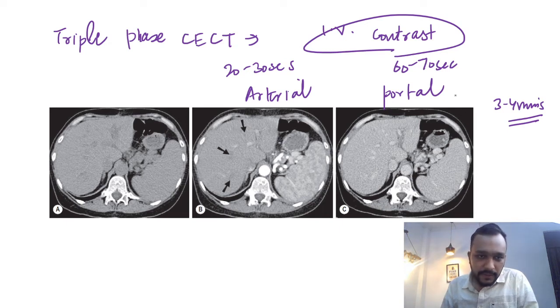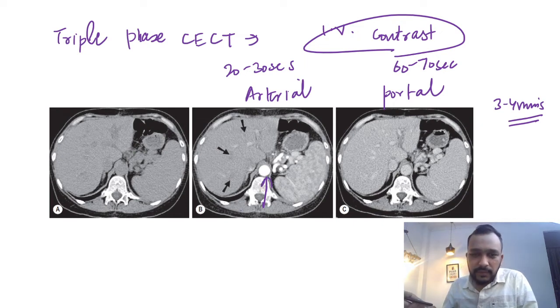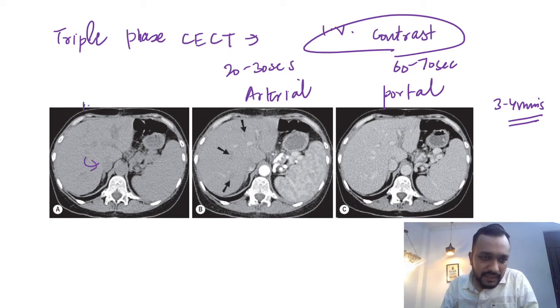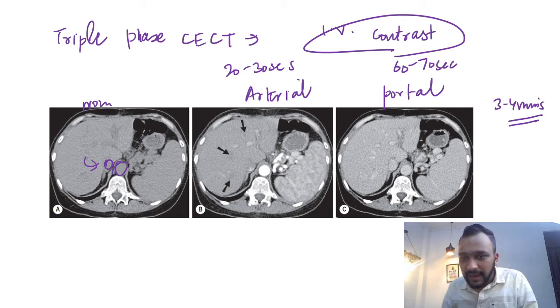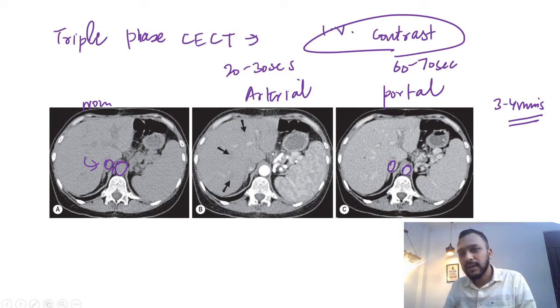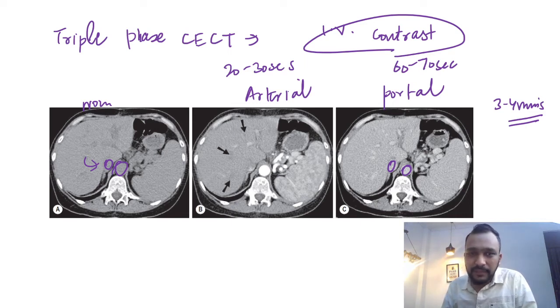To identify these phases, we look at the enhancement of the aorta and IVC. In the arterial phase, only the aorta is enhancing and the IVC is not enhancing much. In the non-contrast phase, both IVC and aorta are not enhancing. In the portal venous phase, both the aorta and IVC show similar enhancement.